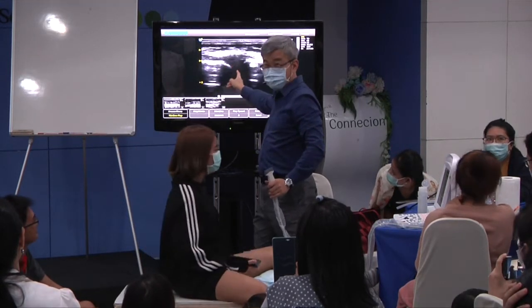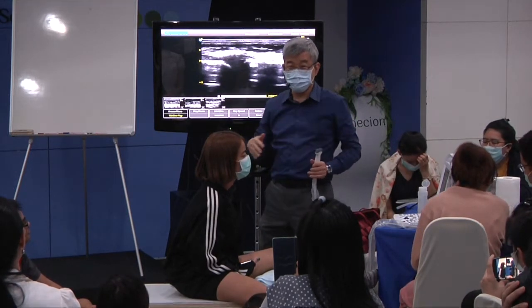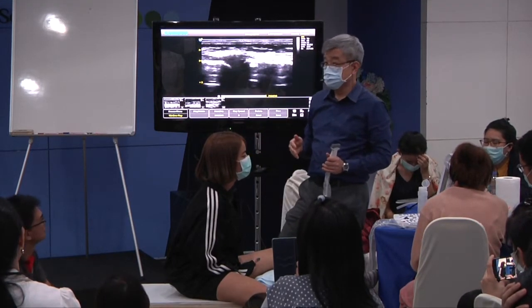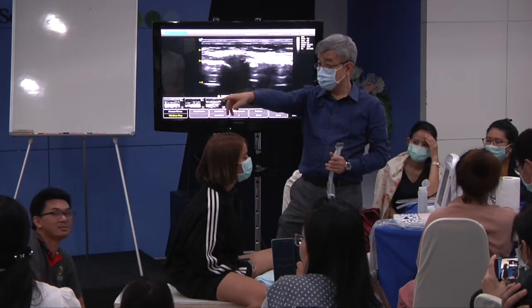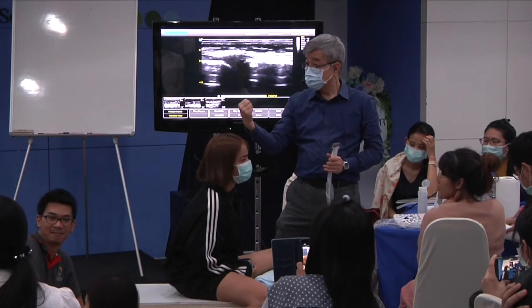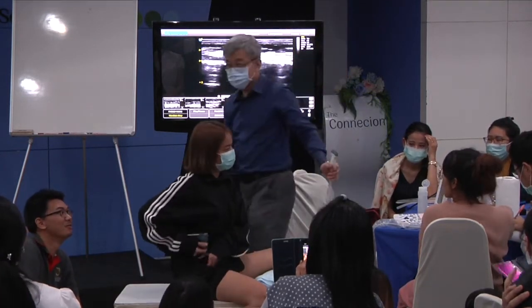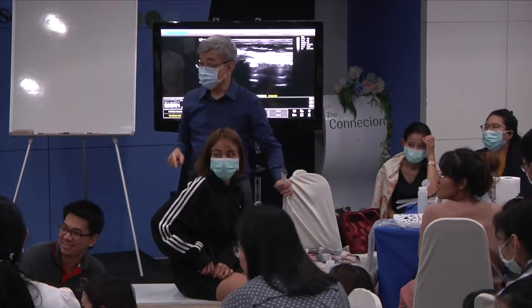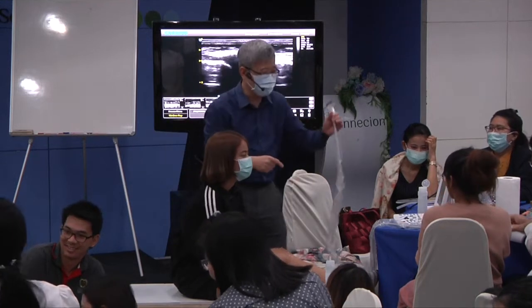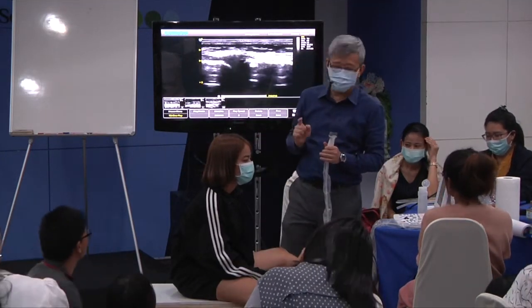As long as you find the heart shape, you just keep moving forwards and backwards, and you get a lot of the structures you need. Okay, do it for me. Come on. Okay, that's very good.